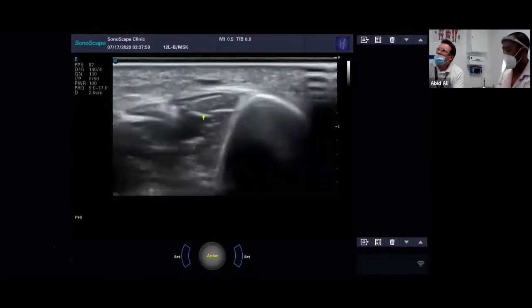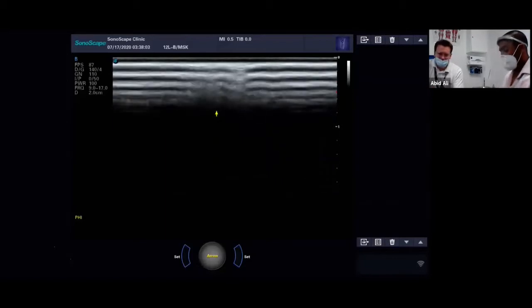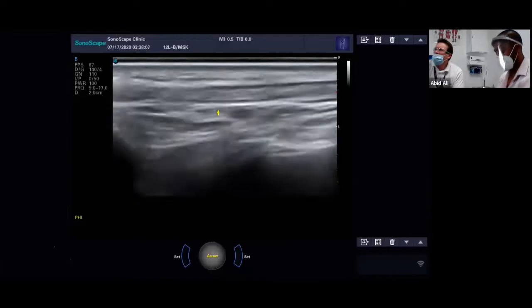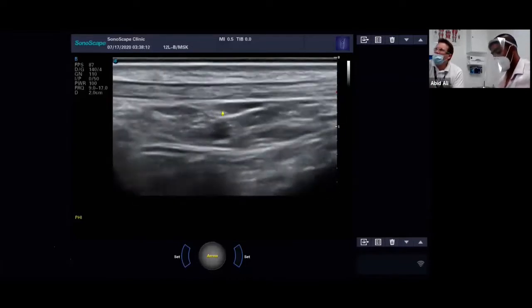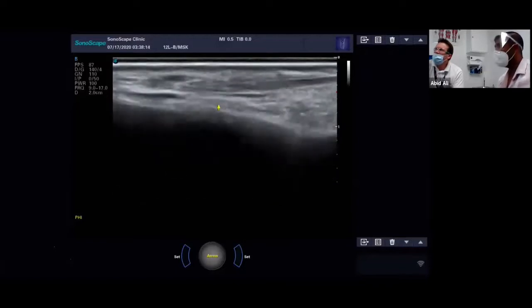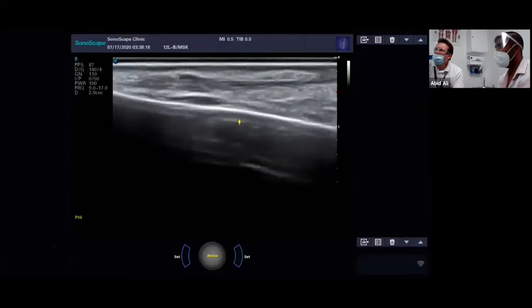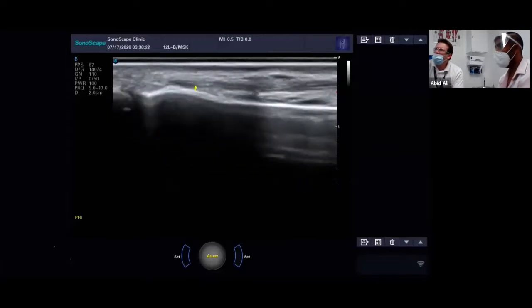Back up the tibia. Right. Let's have a little look at the next structure. So we've got our Tibialis Anterior. Just dorsiflex ankle again for me. Let's have a look at Extensor Hallucis. We did cover this in the big toe, so I won't spend too much time here. Let's just get that in the view. Well, let's follow this.